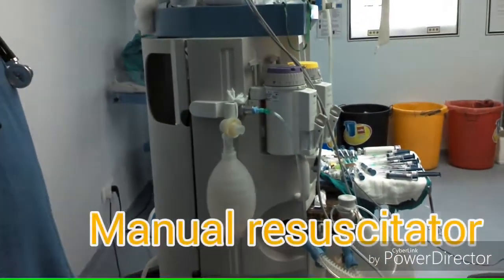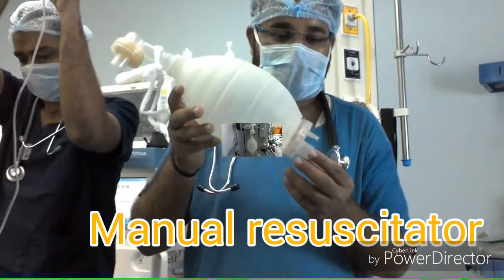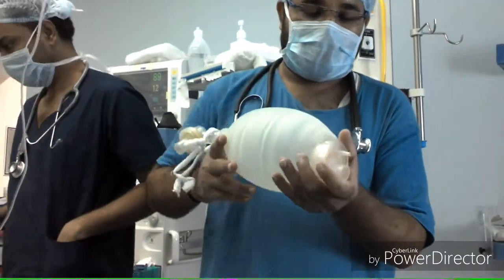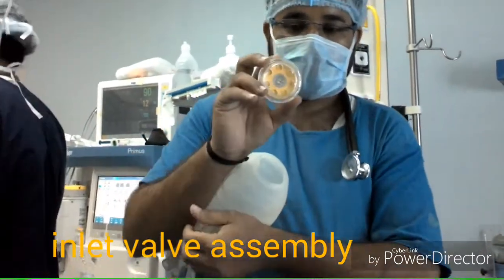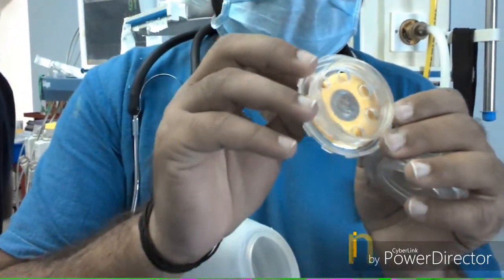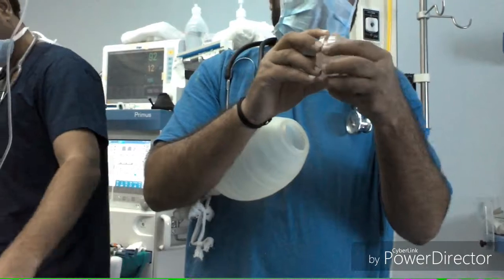Manual resuscitator, most commonly called Ambu bag, artificial manual breathing unit. Inlet valve assembly has a paper-thin yellow colored valve which permits air entry during bag expansion but no exit of air during compression of the bag.